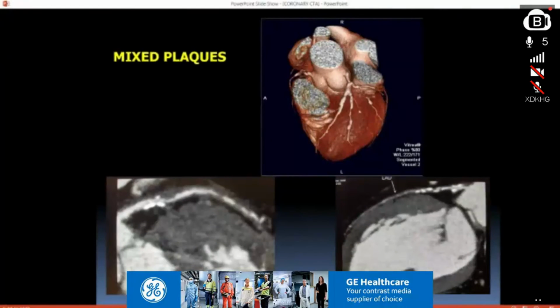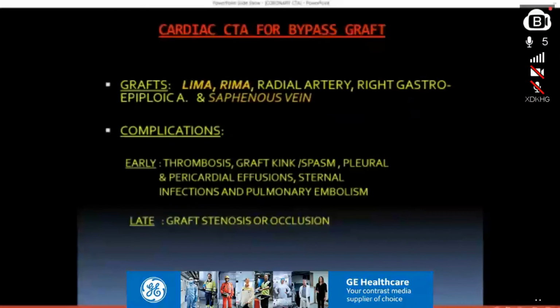And in this case, you can also appreciate subendocardial ischemia that is setting in. And on the color 3D map, you can see the anastomotic points and the distal vessels beyond. You need to stabilize pulse rates in patients with CABG as well.